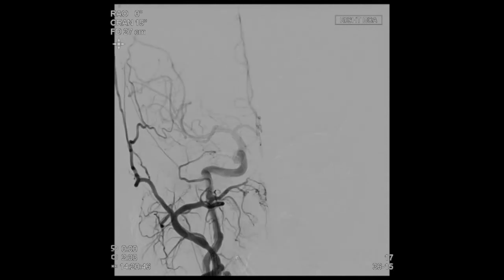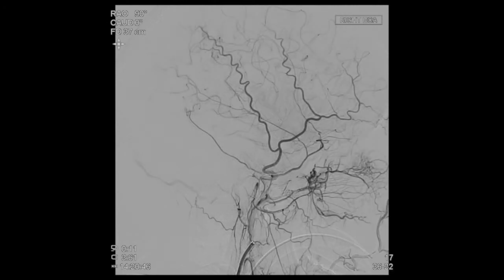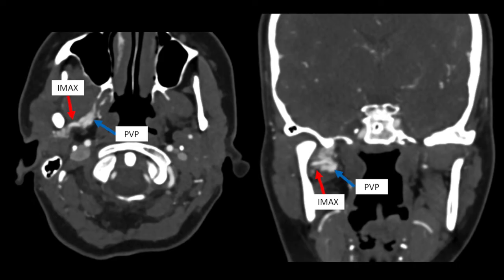Post-treatment angiogram demonstrated complete resolution and angiographic cure of the arteriovenous fistula. We did do a complete 6-vessel angiogram following the procedure to make sure that there were no additional feeders to the arteriovenous fistula. A concern was raised regarding the potential of coils protruding into the buccal mucosa surface. However, as seen here, the malformation was separated from the buccal mucosal surface by a layer of pharyngeal constrictor muscles.